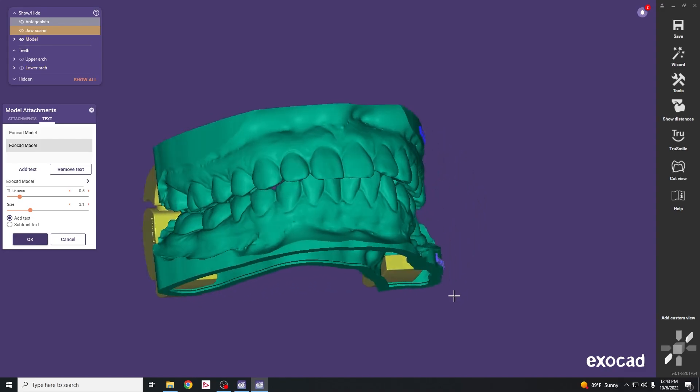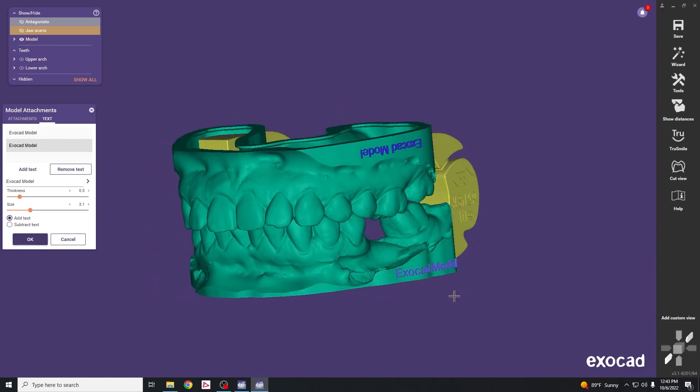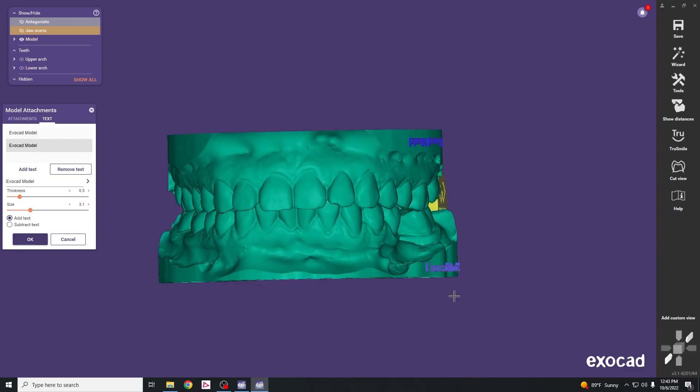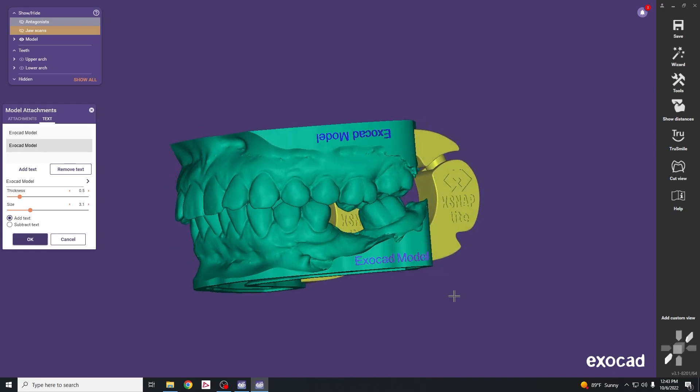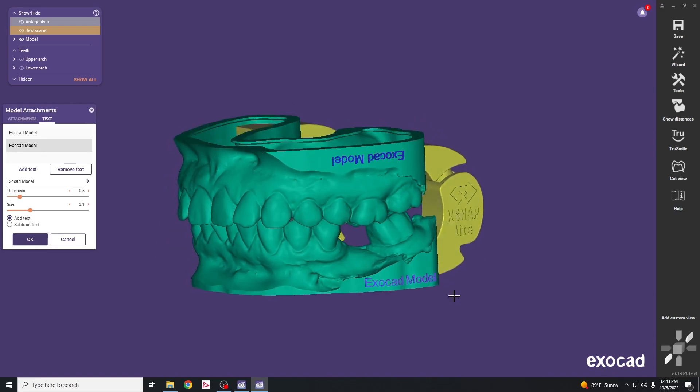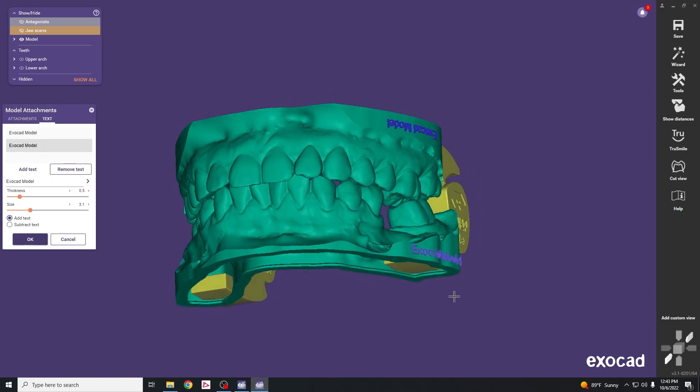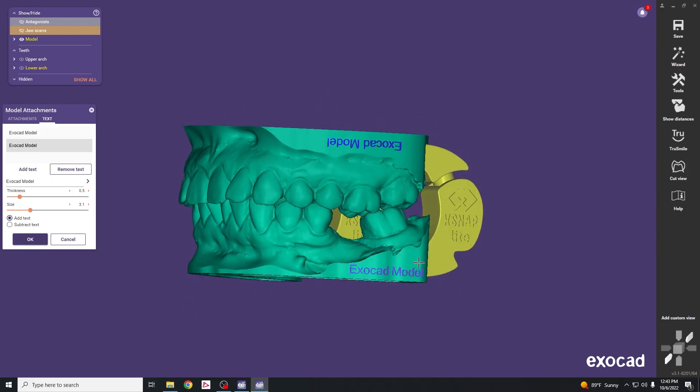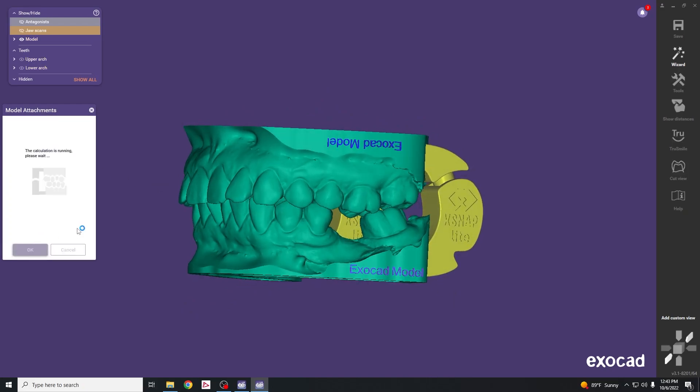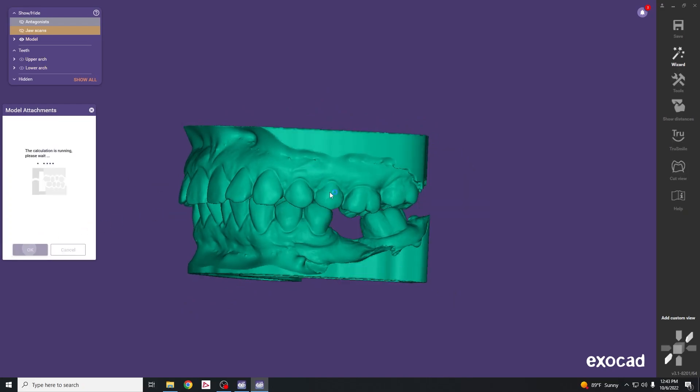It's important to put the name on the cast, otherwise if we print it without the name we wouldn't know how to track what patient those teeth belong to. Once that's done, hit OK to finalize the model.